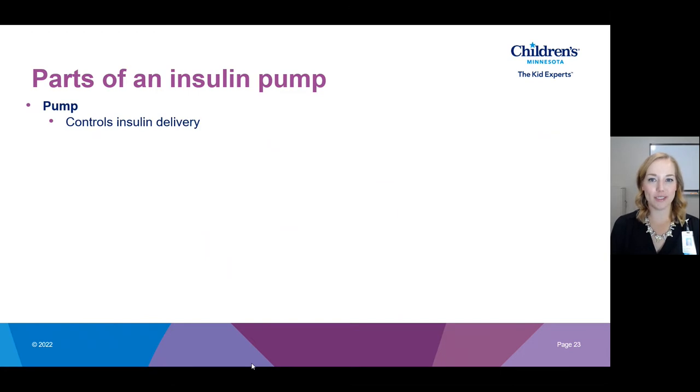For an insulin pump there are three main parts. The first part is the actual insulin pump — this is the part that is managing insulin delivery.